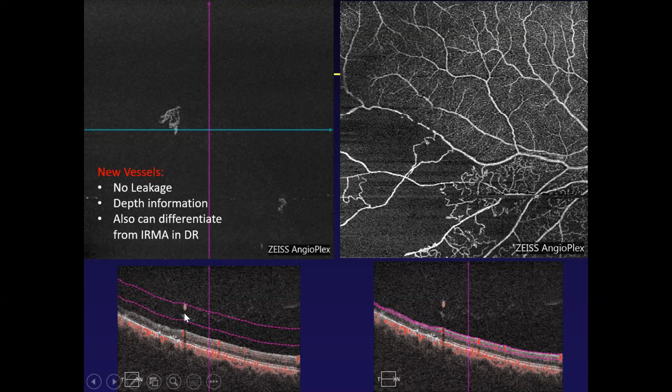These are clearly in front of the retina. So these two fronds of vessels are neovascularization. The whole picture is in keeping with the same information that I could get from the FFA. So generally in diabetics and RVO patients, I have been performing much less FFA lately.